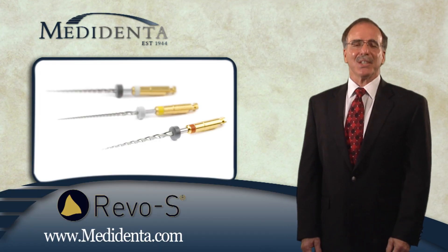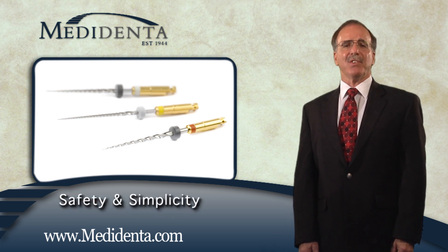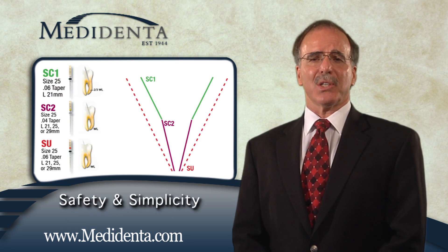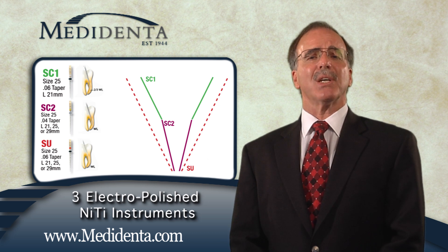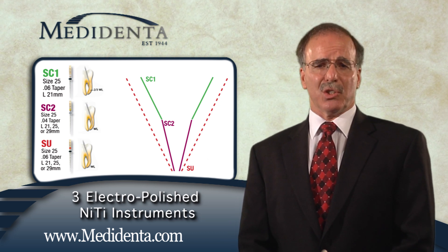REVO-S is a customized endodontic instrumentation sequence for most root canal anatomies, providing safety with simplicity. The REVO-S instrumentation system consists of three electropolished NITI instruments: SC1, SC2, and SU.